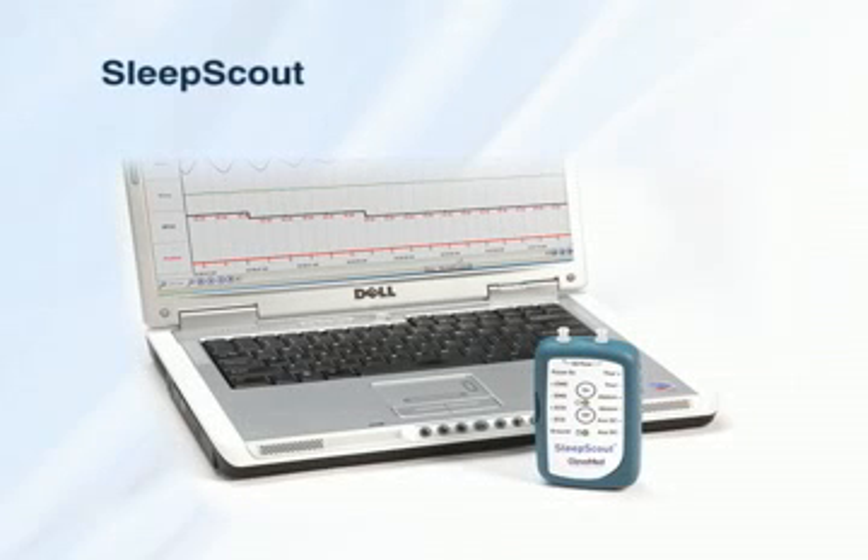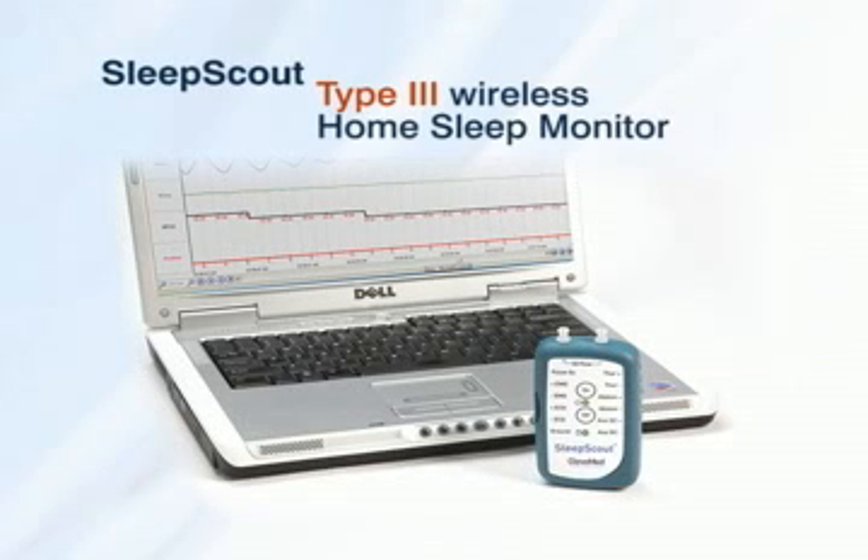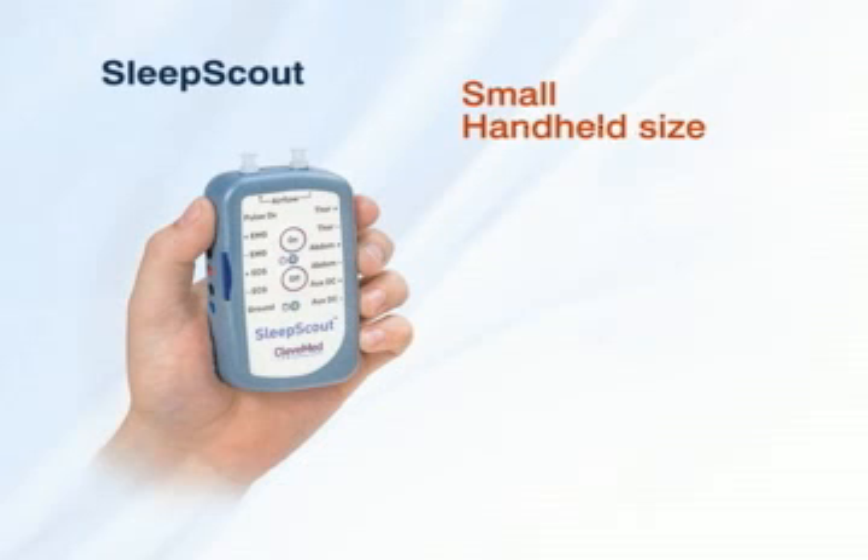Simplify the monitoring of sleep disorders with Sleep Scout, a nine-channel wireless home sleep monitor for assessing sleep disordered breathing and periodic leg movements. The system's wireless design, ease of use, and small, hand-held size make it the ideal option for unattended sleep studies or for hospital inpatient diagnosis.